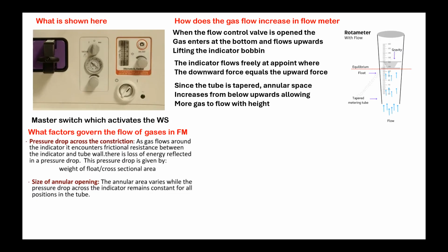No, I'm not asking about the relationship between the flow and this. What is the simple meaning of density and viscosity? Density is mass per volume, sir. Density is the mass per volume. Very good. Viscosity is the resistance to flow. Resistance to flow.